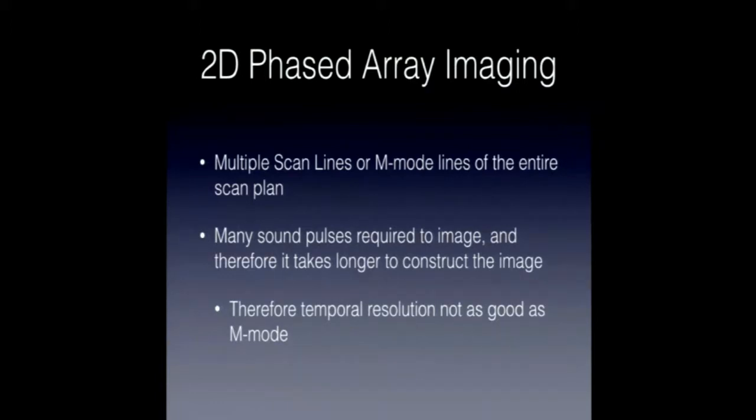Yeah. I guess I've somehow put this slide in. This is 2D imaging, but I want to add in the concept of phased array. Okay, so we'll talk about that in a minute. So as Guy mentioned, M-mode was one of the first kinds of imaging, and then they added a whole bunch together to form a sector and grayscale or 2D imaging. Okay.